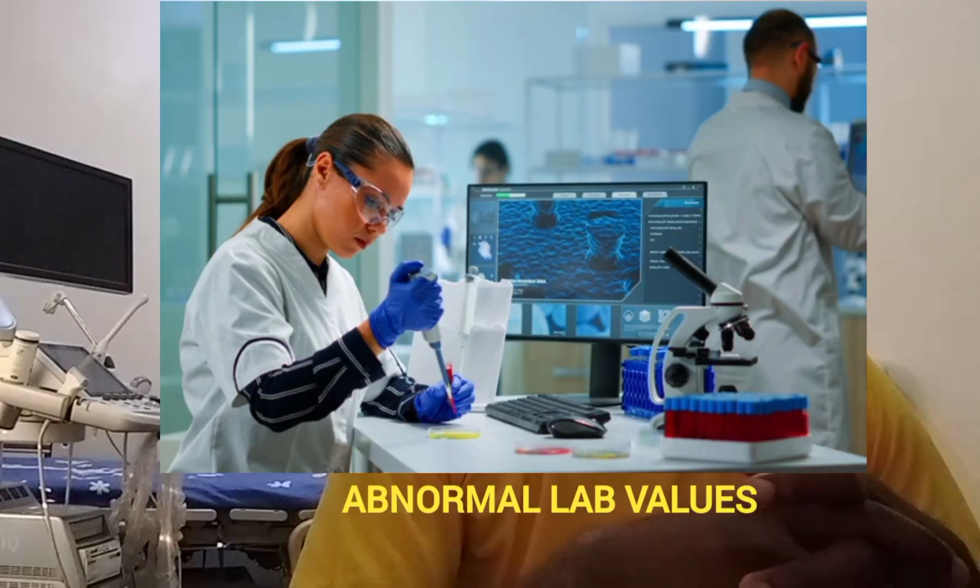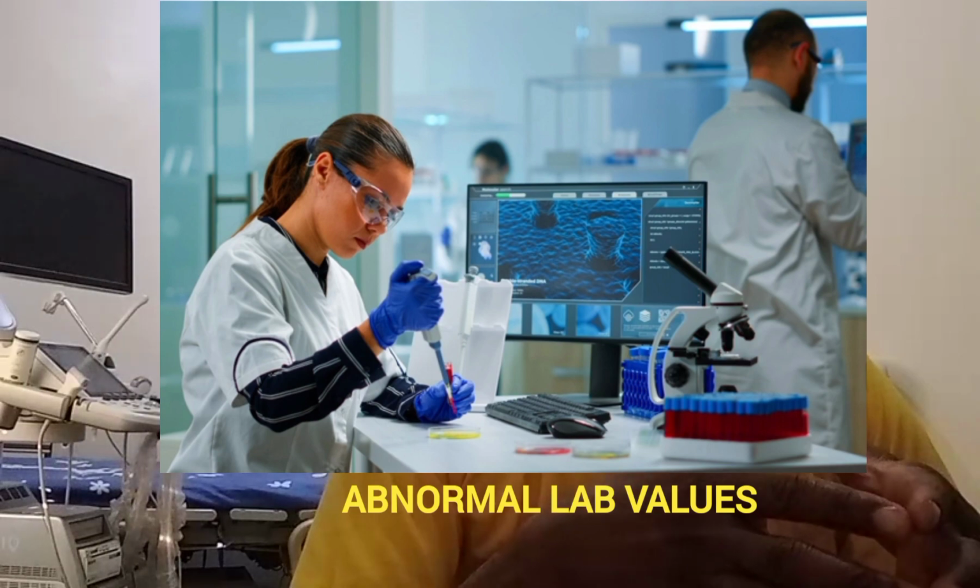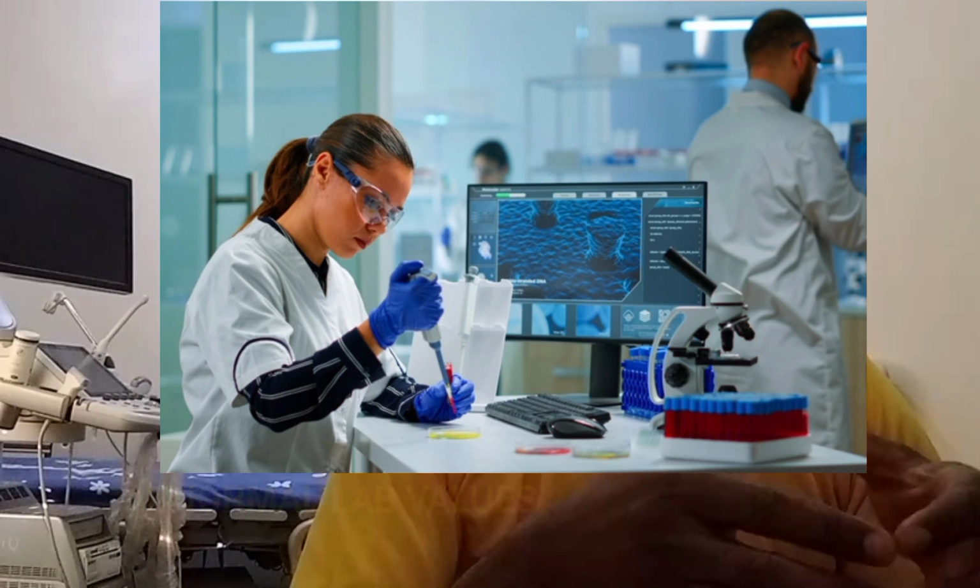Also, you do pelvic ultrasound where you have abnormal lab values. For example, maybe you have a high CA125 lab value.